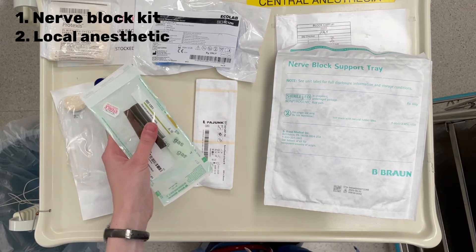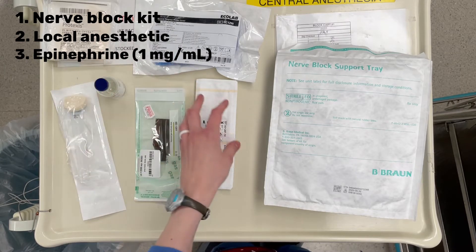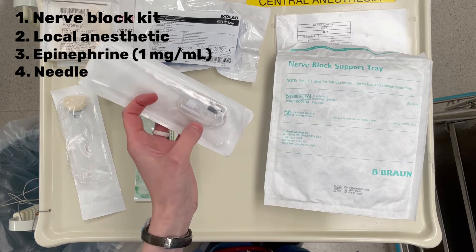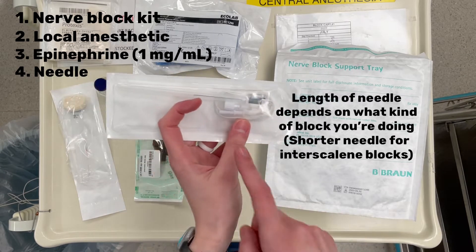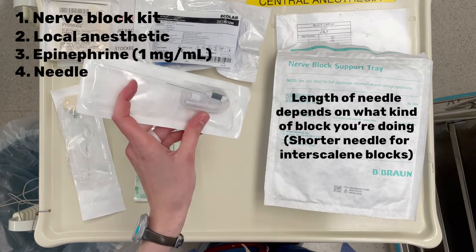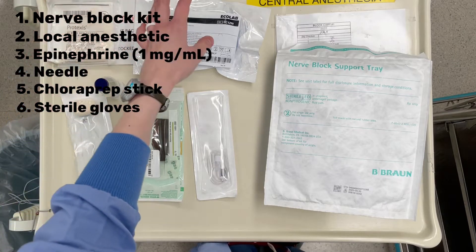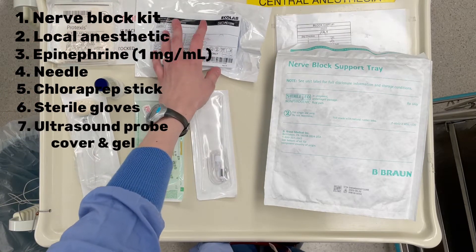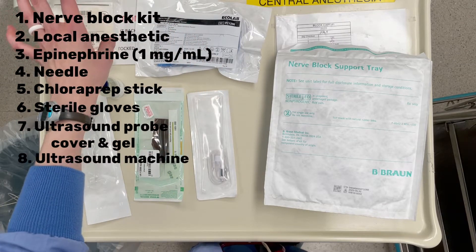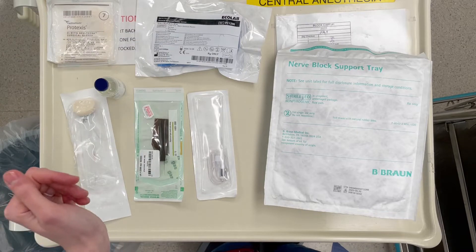You'll need epinephrine — this is one milligram per milliliter. You'll need a needle: an echogenic needle with a catheter on the end. Usually I do the green one that's a little longer, but there are more of these in the supply room so we'll go with this. You'll need a chloroprep stick, sterile gloves, ultrasound probe cover and gel. You'll have your ultrasound to the side.